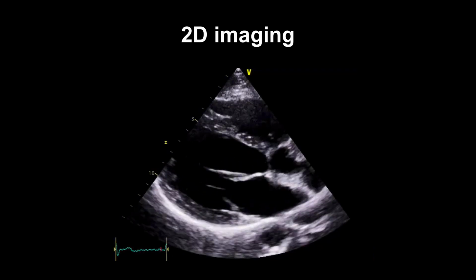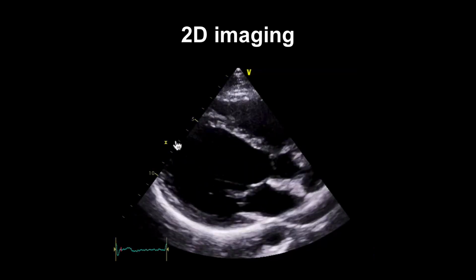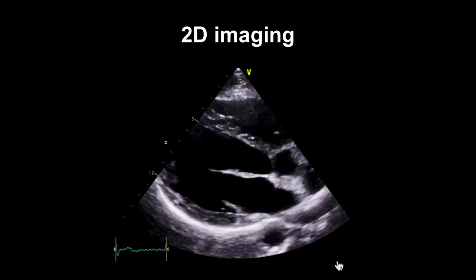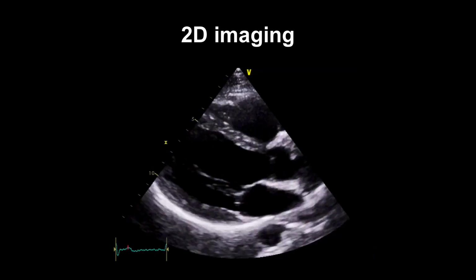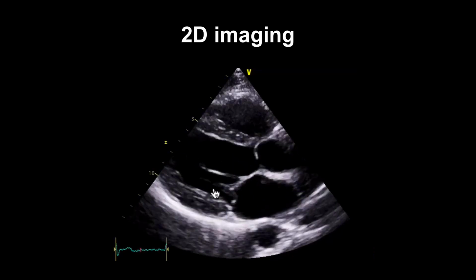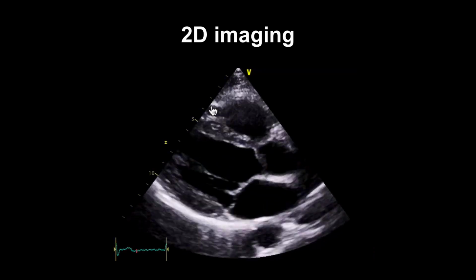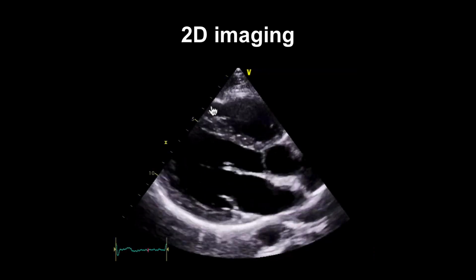So this is what these look like on a 2D image. Just like the cartoon, the probe is here, and these other scan lines are coming down as the sector updates its image. So it goes from here over to here. So you can see how the lateral resolution is being affected. You can see how our temporal resolution is being affected as we look at this mitral valve here, and how any resolution in this plane, our axial resolution, will be affected as well. So what you need to remember is that you, as the echocardiographer, can control all of those things. Okay, and that's a very important thing to remember.